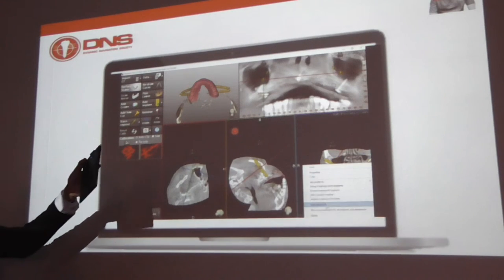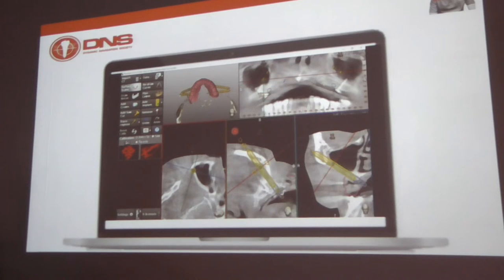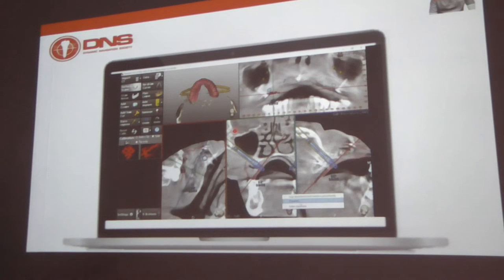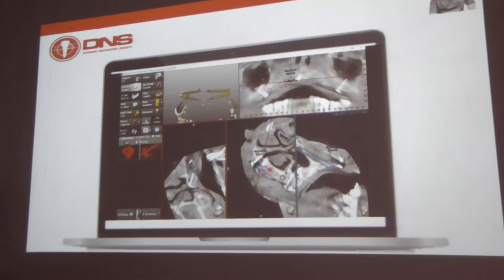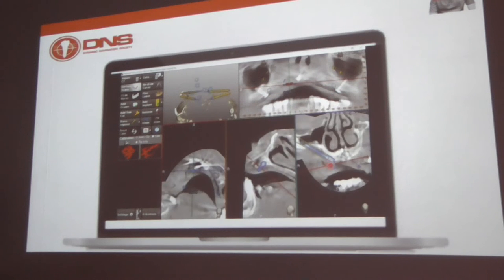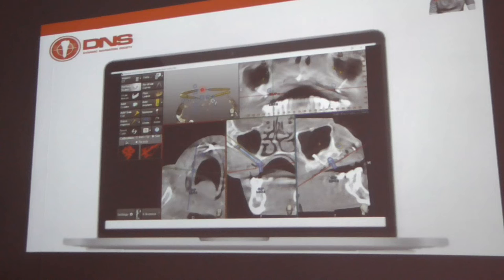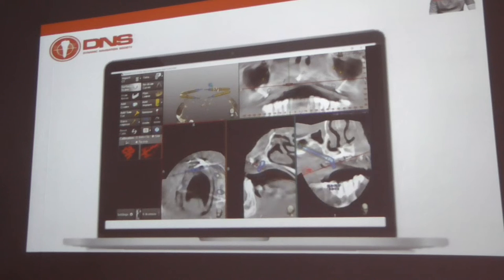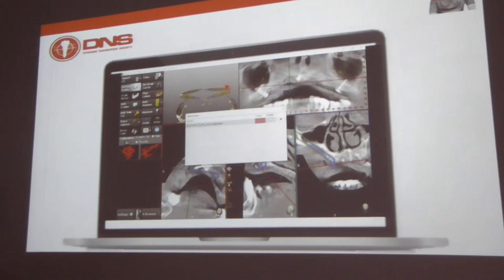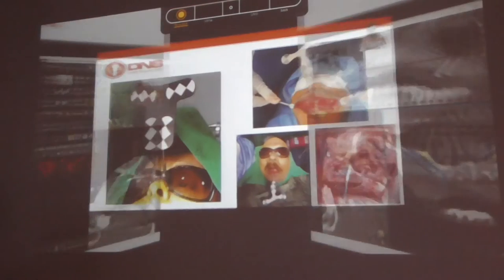So for abutment planning, finally it's an eyeball technique. I would use 45-52 because I use that company's implant which provides 45-52 abutments, and make sure that they are sort of parallel, both along the tooth surface on this view as well as in the 3D view, so that I know my exit points on the prosthesis and also on the ridge. So this is how I do my abutment planning, and then I will check it with my STL just to make sure that I know what position my screw channel is going to be.